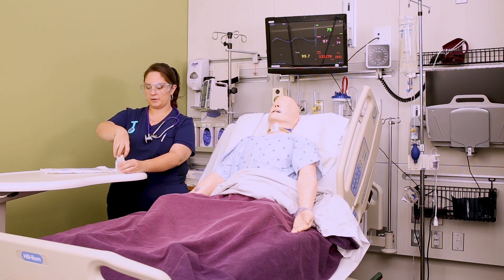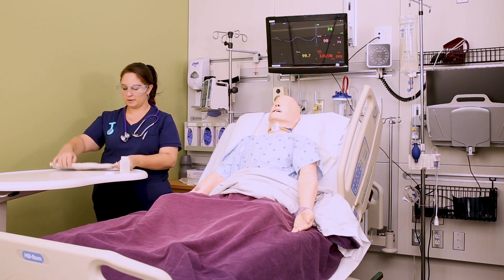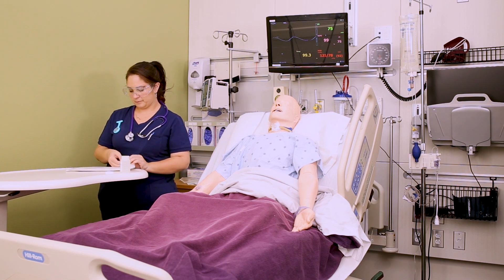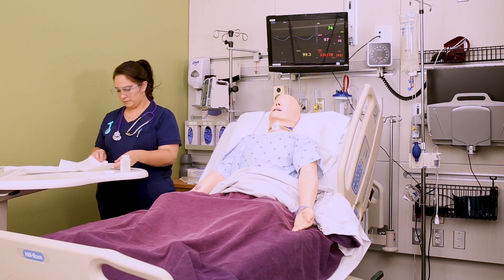The first thing you want to do is open your sterile water container and just set the bottle on the table between you and the suction kit. Now you can open your suction kit and put on your sterile gloves from in that kit. Sometimes they're all bunched up and sometimes they have their own package, so depending on your kit just be really careful to make sure that you keep them sterile.